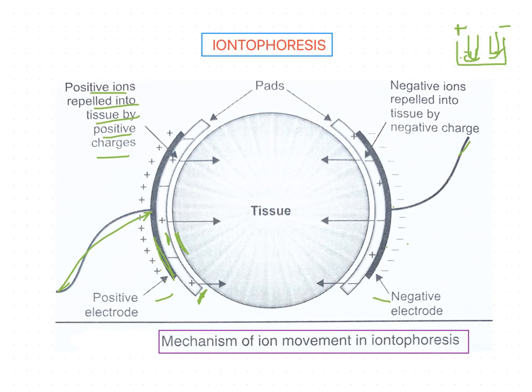In the pads we get negative and positive ions. The positive electrode, that is the anode, has a positive charge, so these positive ions are repelled and enter into the tissue.